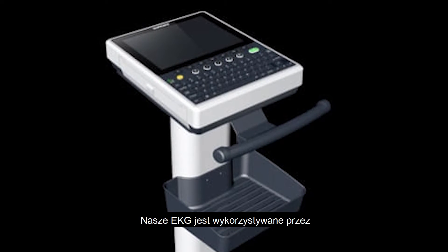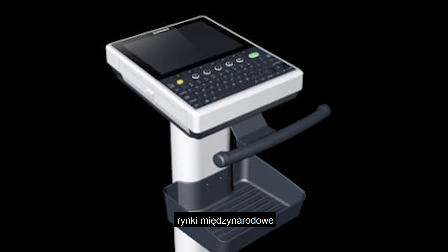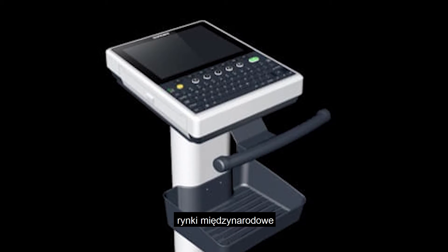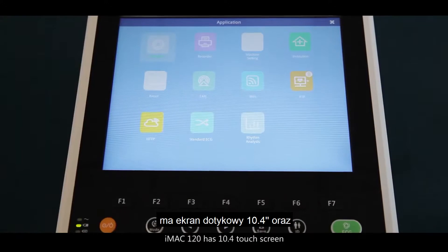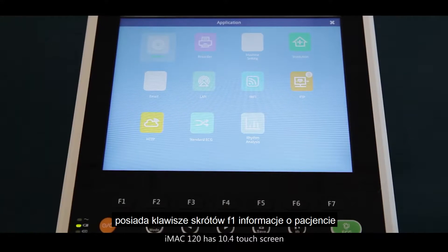This is iMac 120. It's a 12-channel ECG machine and is warmly welcomed by the international markets. iMac 120 has a 10.4-inch touch screen.